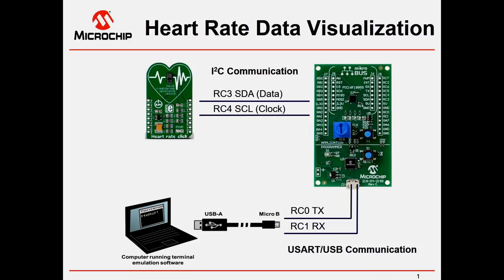This idea can be applied to many other different types of clicks, many other different types of sensors that we have. You're just going to plug this in and get the data, set up all the peripherals and everything in MPLAB Xpress IDE, which I'll talk about a little bit later in detail, and then get the data off. If you want to view that data, we use the built-in CDC link, which is the communication link in the Xpress board, and transfer the data over to the computer. And we'll actually see how we can use that data to plot a graph.